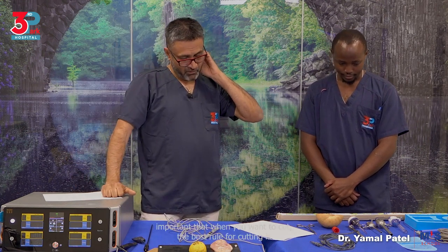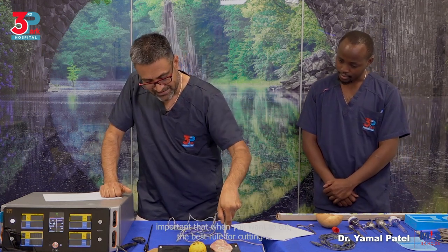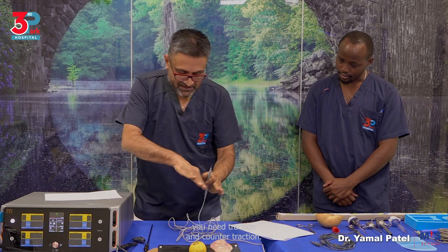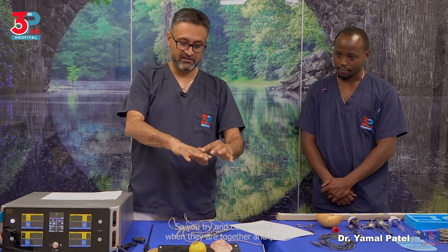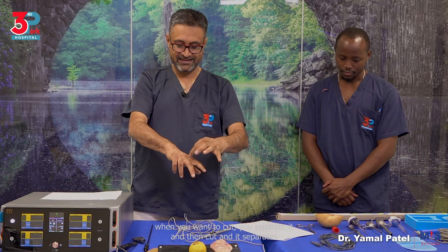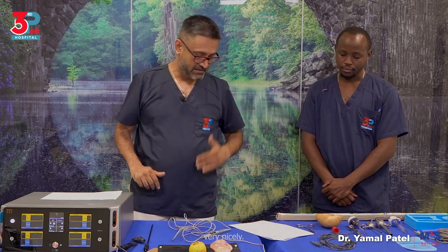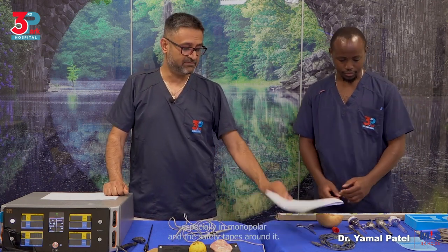Finally, it's important that when you want to cut, the best rule for cutting is you need traction and counter traction. So it cuts best with some tension in the tissue, and it coagulates best when there is no tension in the tissue. So you try and coagulate it when they are together, and when you want to cut, you separate it and then cut, and it separates very nicely. So these are rules of use of electrosurgery, especially monopolar, and the safety tips around it.